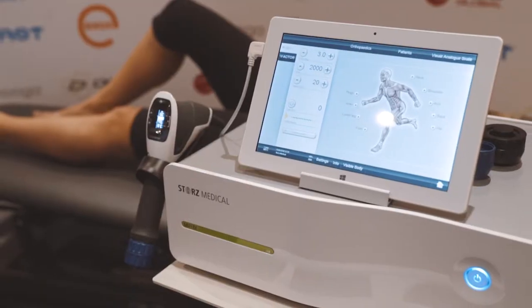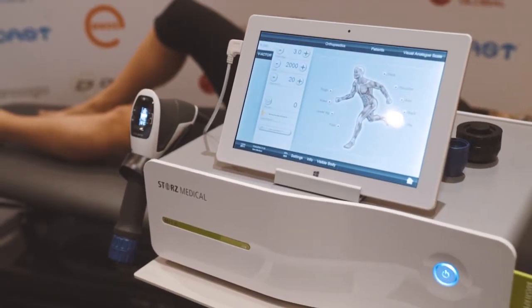The Stortz unit I have here uses radial shock wave and comes with two different headpieces: a 15mm and a 20mm, which we will progress to later.